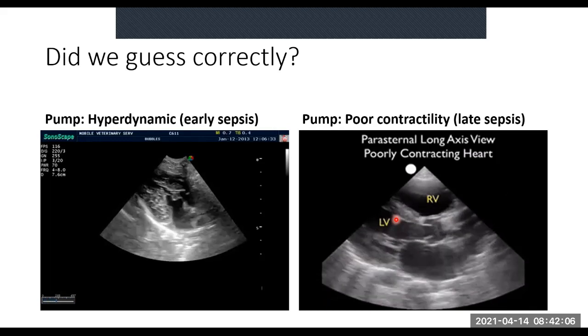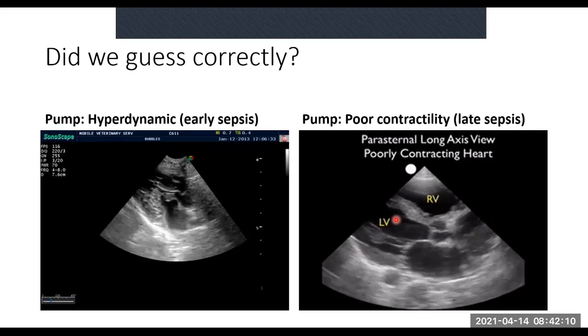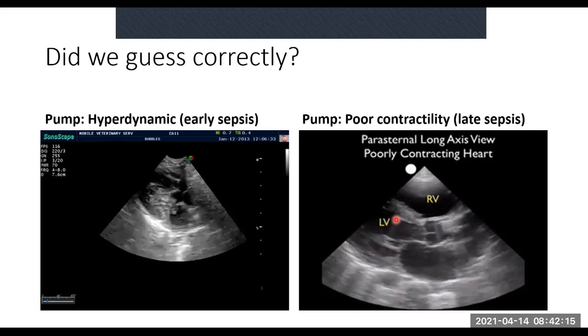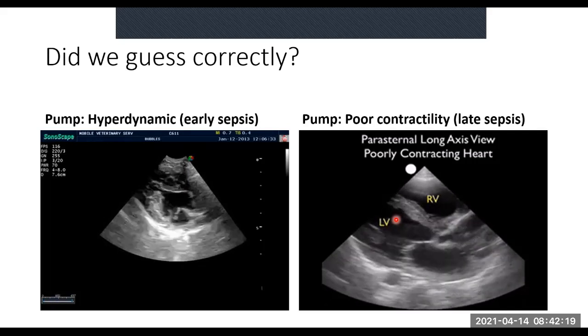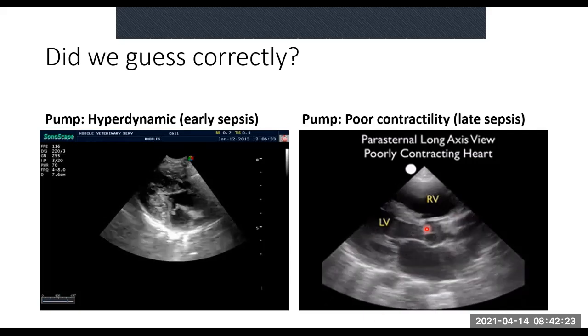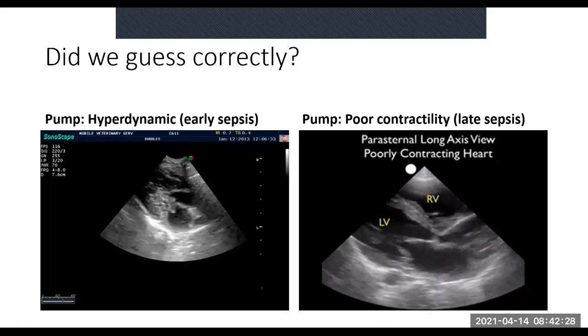Eventually the heart cannot cope. And in fact, if you start seeing bradycardia and you start seeing low BPs in a septic patient, you must know this has progressed quite far. We have a lot of patients who delay coming to hospital. So some of them come and they are very septic right towards the end. And this is actually a poor prognostic sign, this one here. All right. So that's what we expect from the pump.